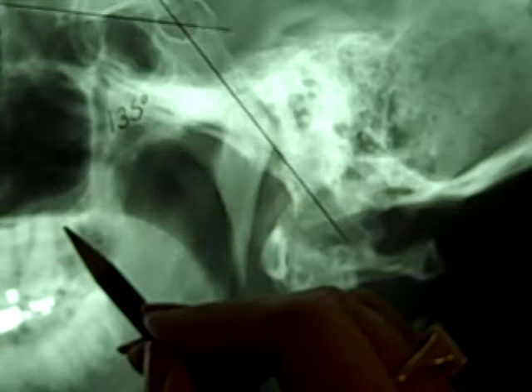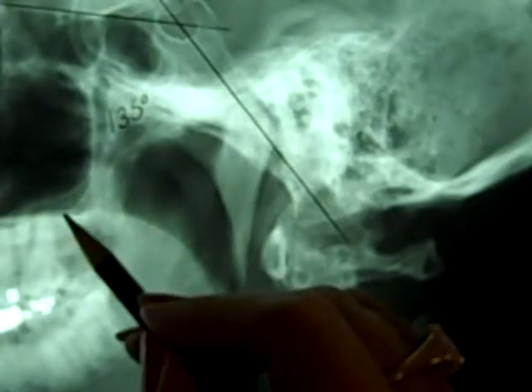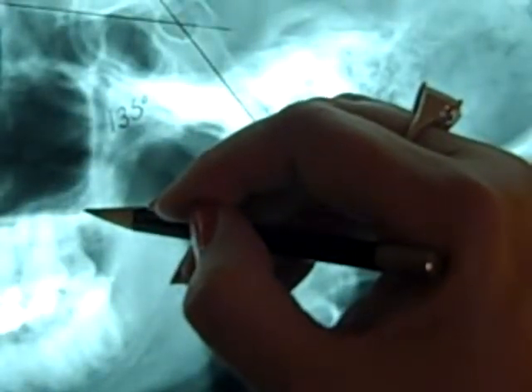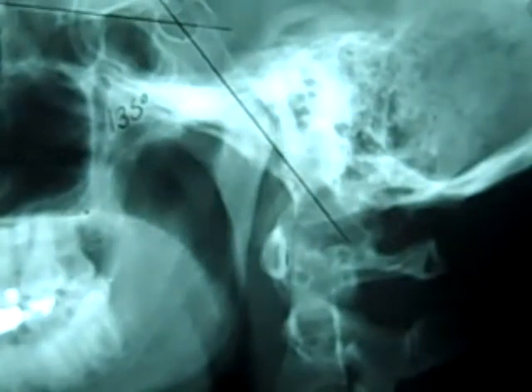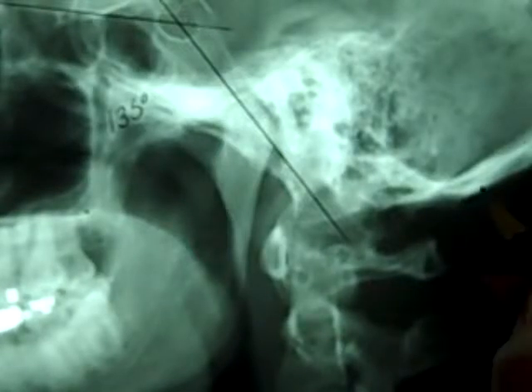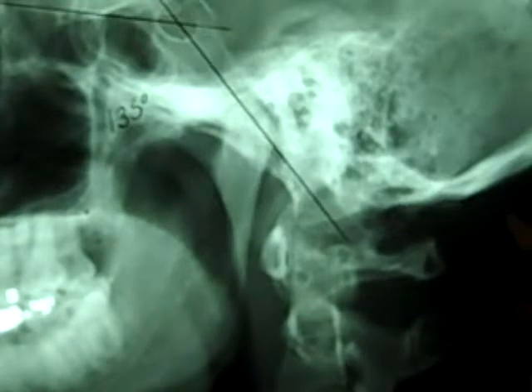And that is this white density that is right here. So the superior posterior aspect of the hard palate would be there, to the inferior or lowest point of the occiput, which would usually be about right here, because that is running right along there. Okay?